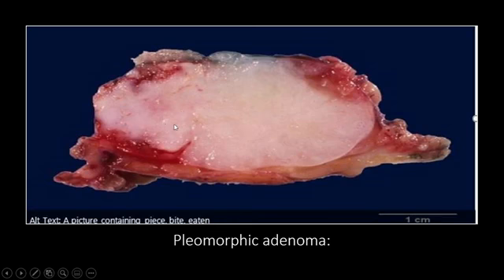It is called glassy, translucent, or chondroid and so on. An important feature is the well demarcation, and no features of invasion can be seen surrounding the gland, and still there is a little area of uninvolved parenchyma.